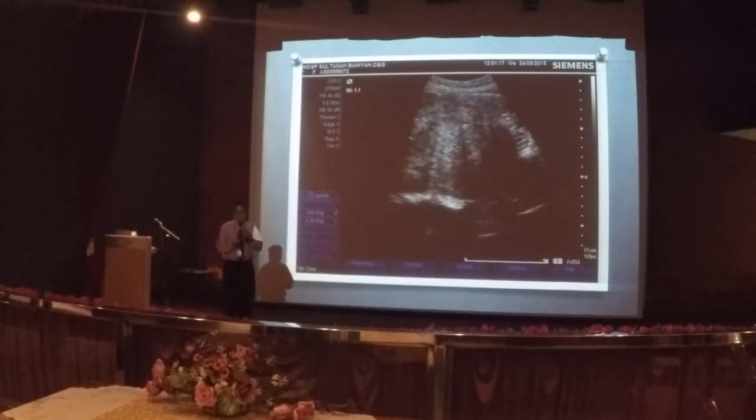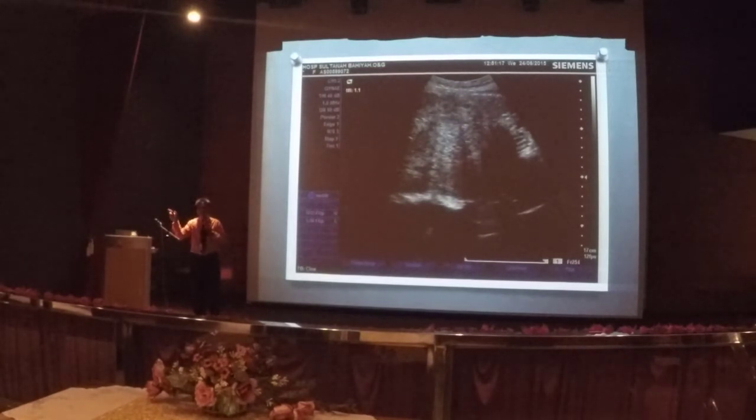One of the characteristics of adenomyosis, you can see dia punya hypoechoic ray below, nampak tak ni? Dia sama macam kalau kita scan on the kidney untuk kita tengok stone kan, dia ada shadow. Pasal apa? Because the ectopic endometrium inside the myometrium will bleed together during menstruation.